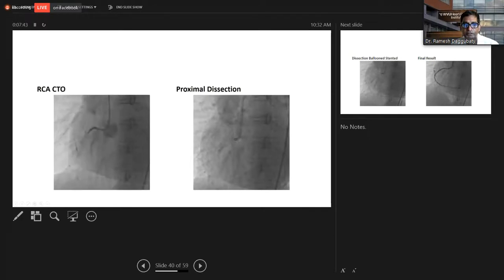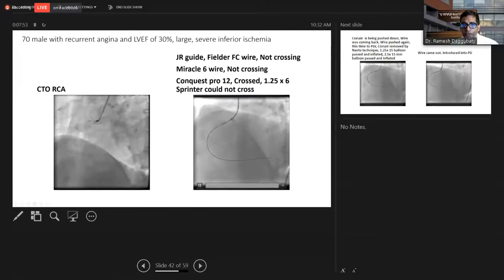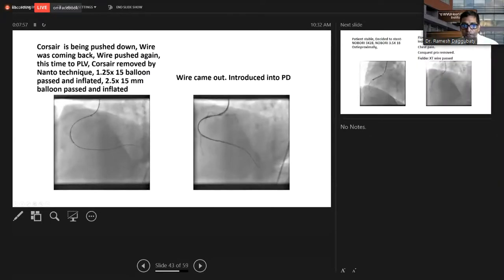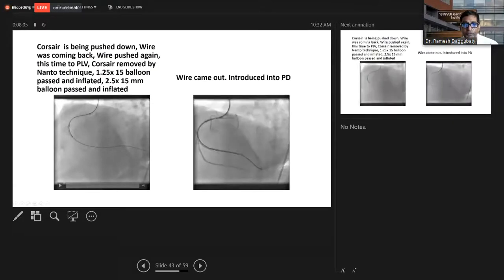So here is another RCA CTO, and I'll show it to you. And obviously crossed with the Miracle 6, which was not successful, then the Conquest Pro. And finally, we were able to establish a flow through this. But the most important part I want to show is the wire position in this screen, and here is the wire position. So the wire was actually in the PLP, and then it was pushed to the PDA. So pushing and pulling the wires should be avoided, absolutely.